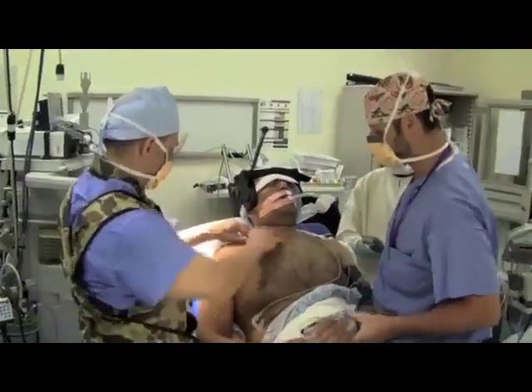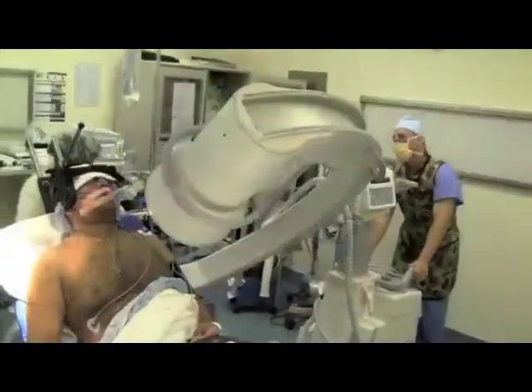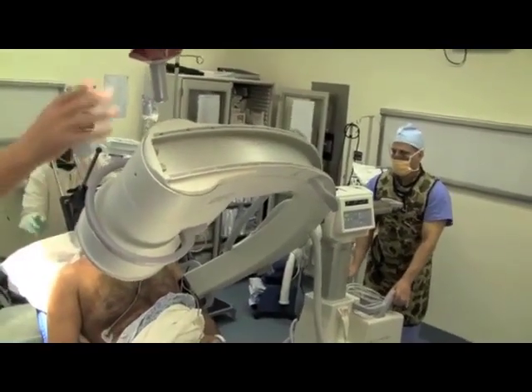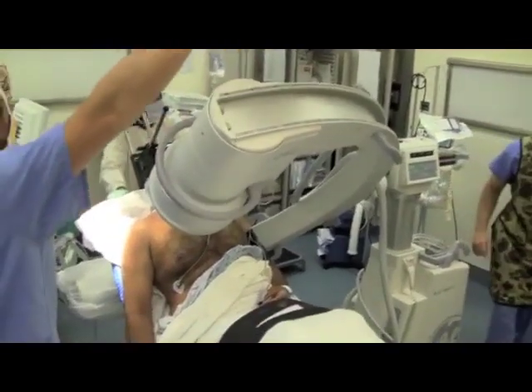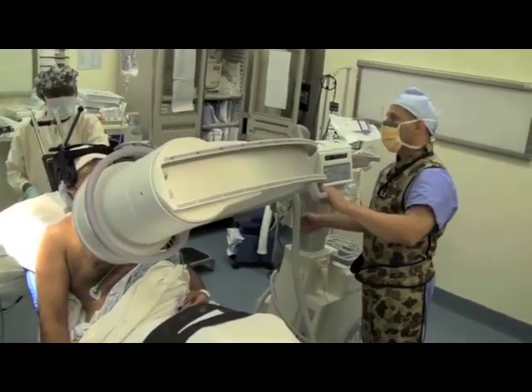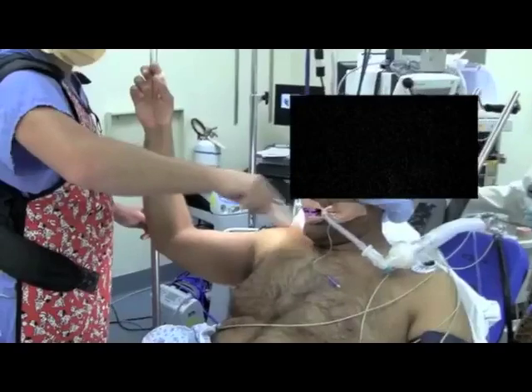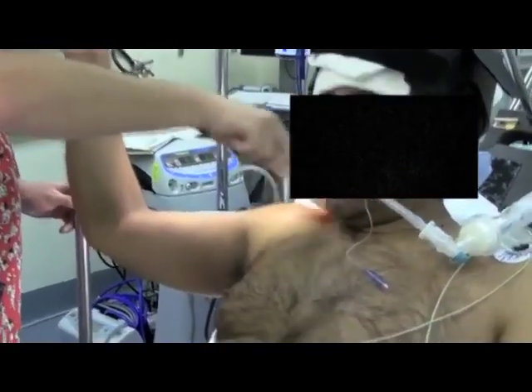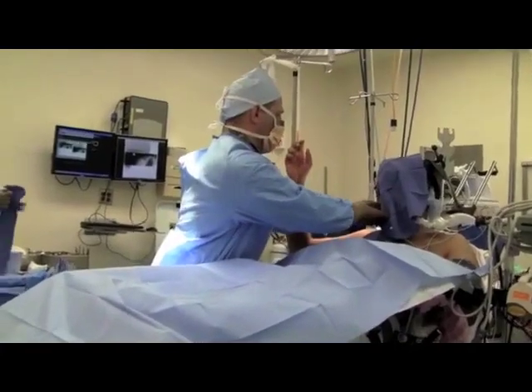We prefer to position the patient in the beach chair position. The image intensifier is brought in from the opposite side of the patient to be out of the operative field. An AP and cephalic tilt view are easily obtained in this position. The entire forequarter and arm are prepped and draped free.